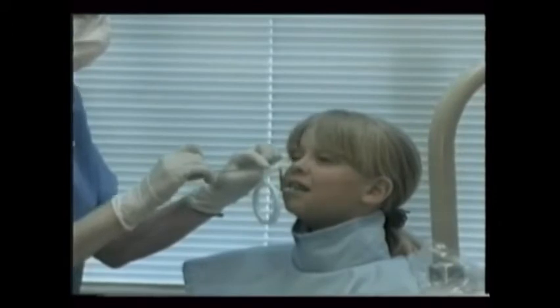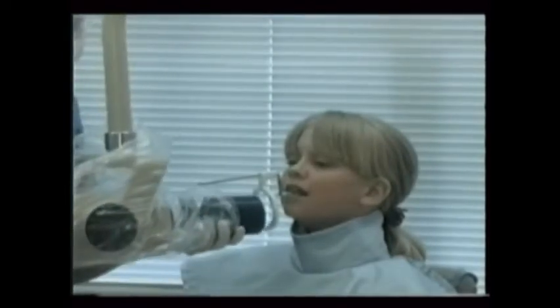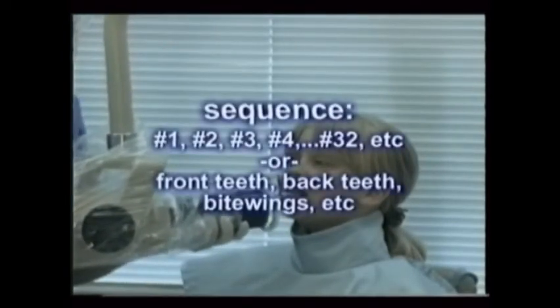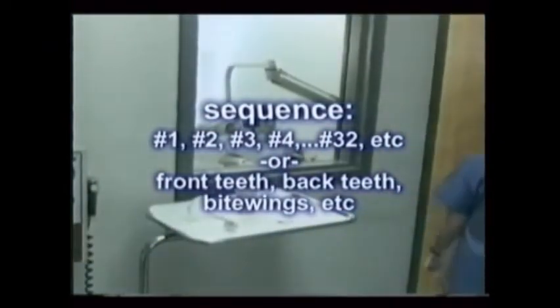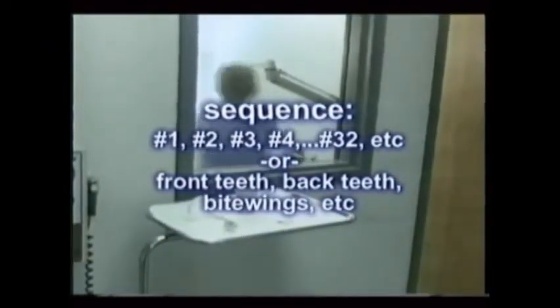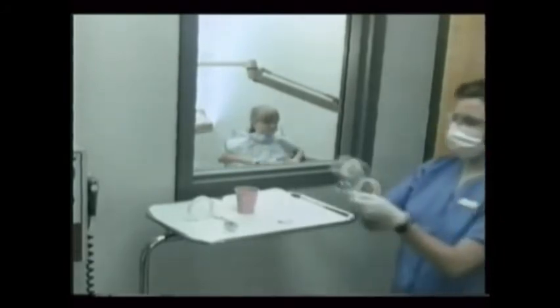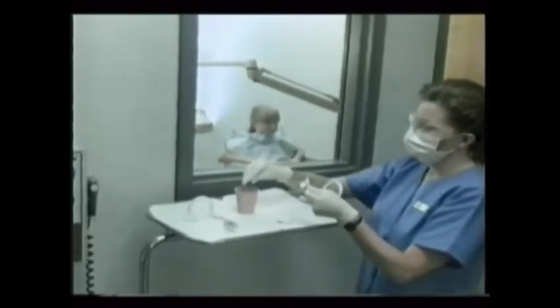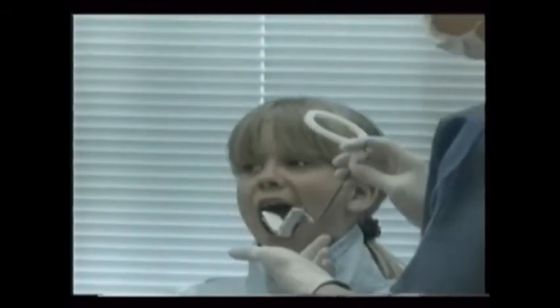Develop an x-ray sequence in your mind so you don't miss any teeth or x-rays once you get started. You also don't want to accidentally x-ray any teeth twice. Start with tooth number one and work your way to number 32, or x-ray the anterior teeth first, then the posteriors, and then do the bite wings. Just develop a sequence and stick with it. Some assistants find it helpful to begin with the anteriors since it's much easier on the patient and reassures them early on. Using film holders, make your exposures.